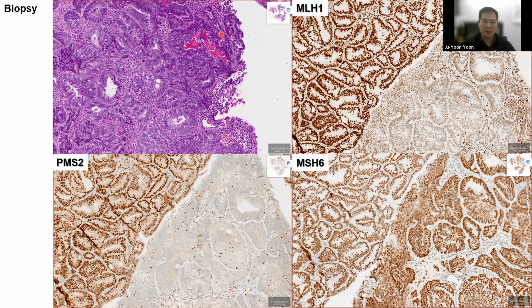But what you see here, comparing MLH1 and PMS2, is a geographical divide in the regions that are showing clear expression of PMS2 and loss of PMS2 in the lesion. And there's some maybe still retaining expression, or at least some immunoreactivity there, but certainly aberrant in the sense that there's a drastic reduction compared to this region here.